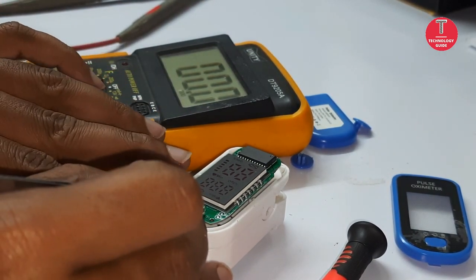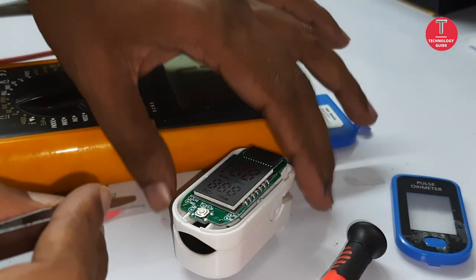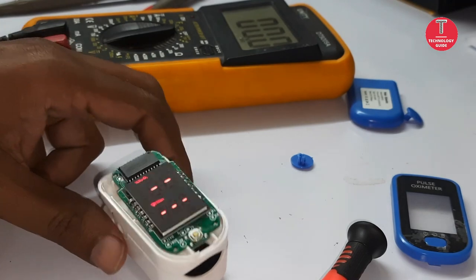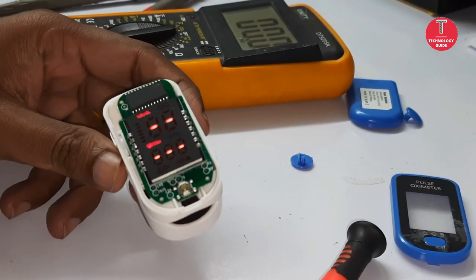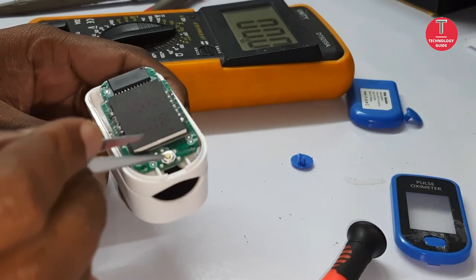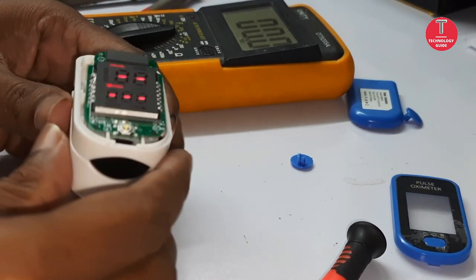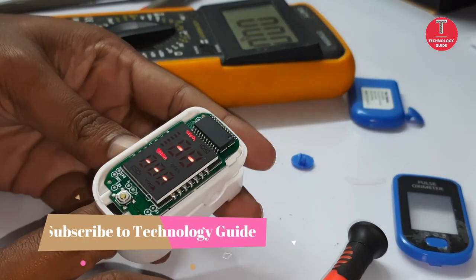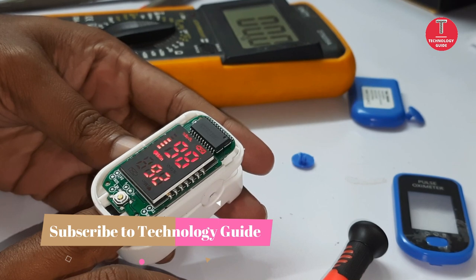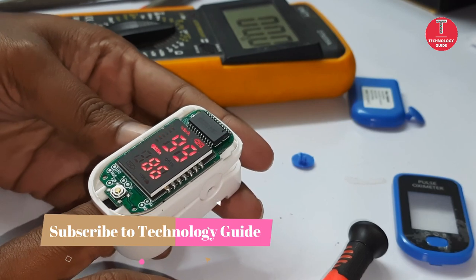Now check the push button if it's working or not by shorting the switch terminals. Now device is on. Yes, it's working and gives accurate results.